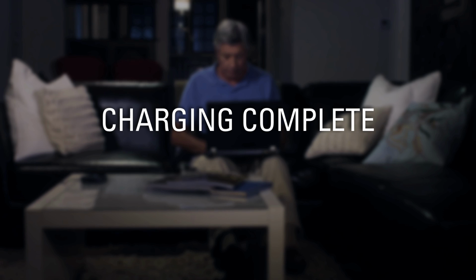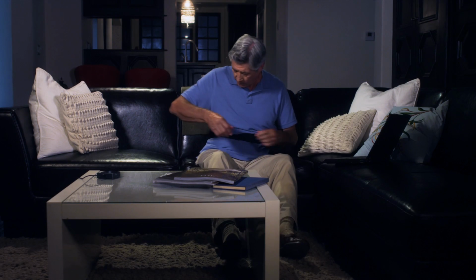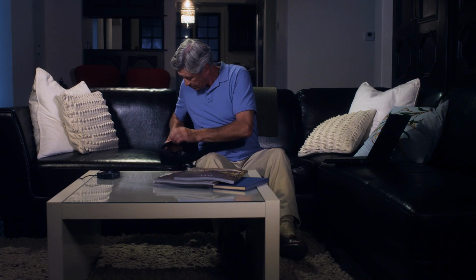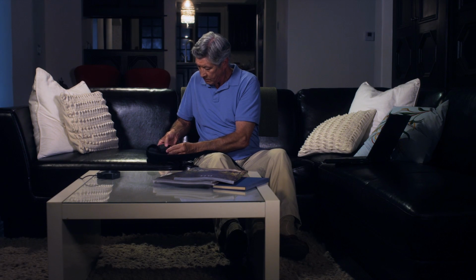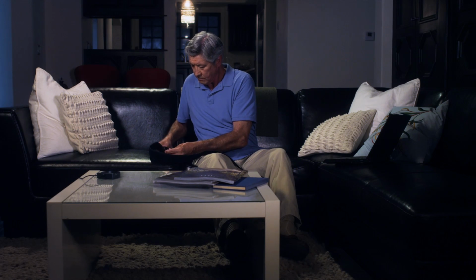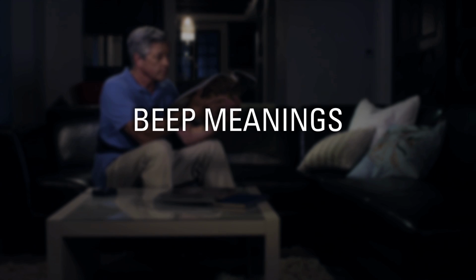Charging complete. When the charger makes a distinct double beep, the stimulator is fully charged. The double beeping sounds for 60 seconds and then stops. At this point, the indicator light on the charger turns off. Remove the charger belt, turn the charger off by pressing the power button, and return the charger to the base station.